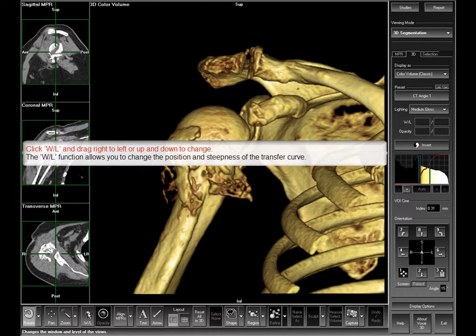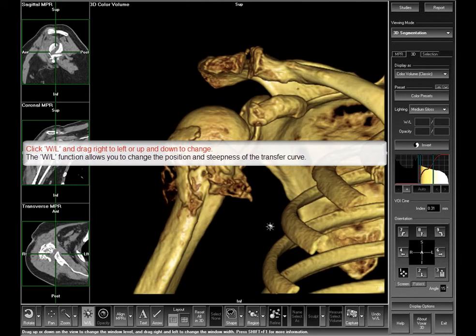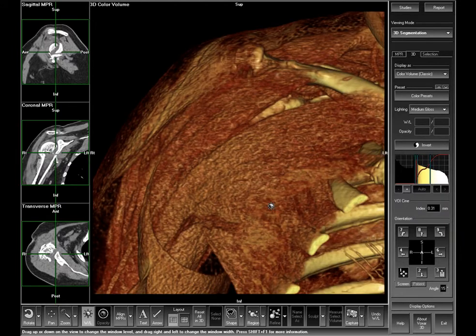Start from an existing preset. You can change the color volume characteristics by means of the window level function. The window level function will change either the position or the steepness of the volume transfer curve.